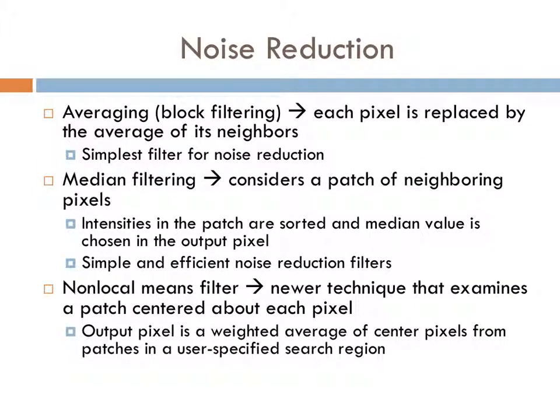Noise is random fluctuations in the image formation that can obscure the true elements in the image, and noise is present in all images. Noise reduction is also called improving the signal-to-noise ratio. We can reduce noise by increasing the radiation in general X-ray or by doing some other things. For example, we can increase the field strength or imaging time in MRI. Image processing does allow us to reduce the amount of noise on an image, but sometimes it increases the artifacts, so it's not always a great trade-off.